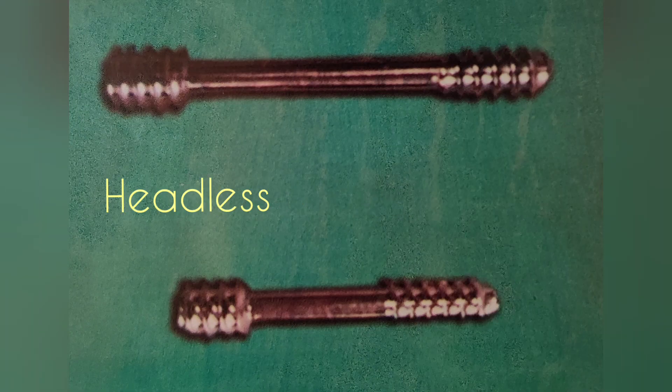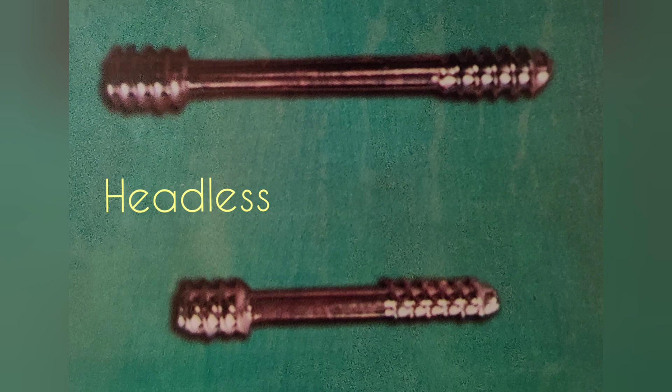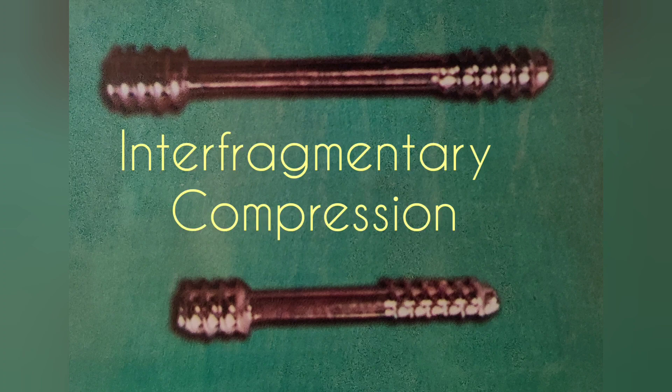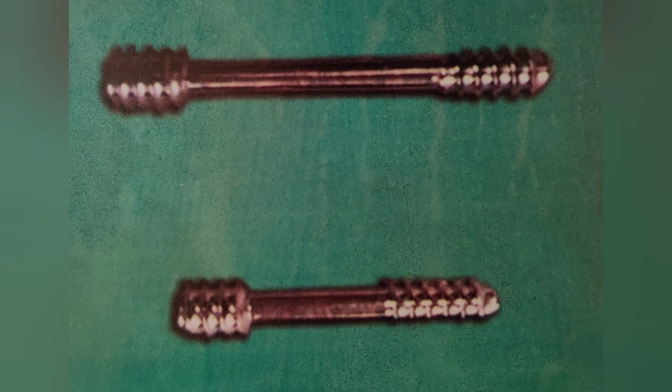Next is Herbert screw. This is a cannulated headless screw. It has a differential pitch between 3 mm to 3.9 mm. It provides interfragmentary compression used for scaphoid fracture, capitellar fracture, radial head fracture, talus fracture, etc.